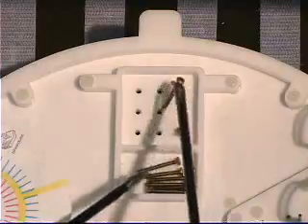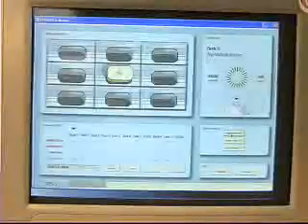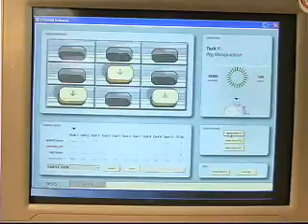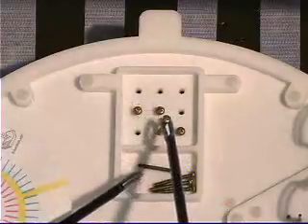The goal is to place 6 out of the 9 pegs in any of the 9 slots on the pegboard. The system senses each peg as it is placed. The task starts when the first peg is picked up and ends when 6 are entered.